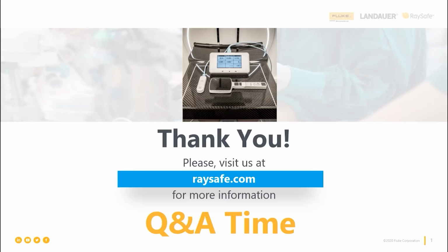Does the X-ray tube age by not being used for many years? Not the tube itself, since it's vacuum inside. There isn't really anything that could happen if there's no air inside. But the whole machine may, of course, age depending on how it's stored and everything.